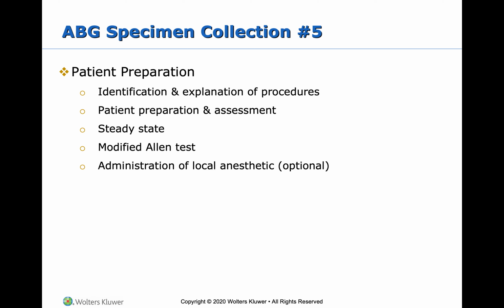So steady state: you want to make sure that they're in a steady state 20 to 30 minutes before collecting the specimen. And what I mean by this is that they have had no exercise or suctioning or respirator changes for that 20 to 30 minutes beforehand.